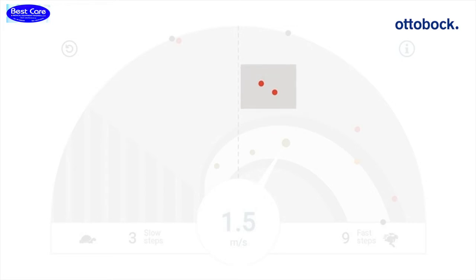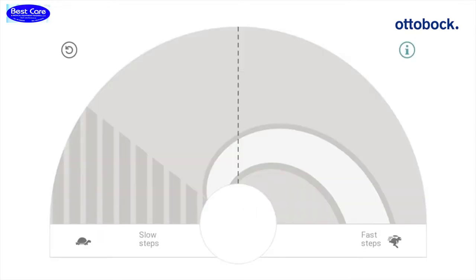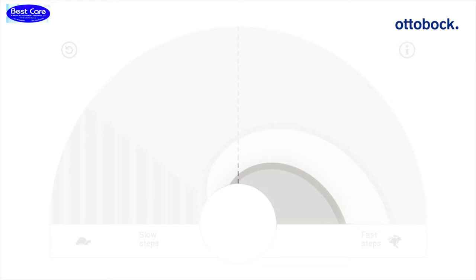Red dots are far outside of the optimal range for the power output. If you click the reset button above the graphic, all dots will be deleted. This may be helpful after making programming changes. When the dots are falling above the white optimal range, the power output is too high. When dots are falling below the white optimal range, the steps do not have enough power output from the foot.